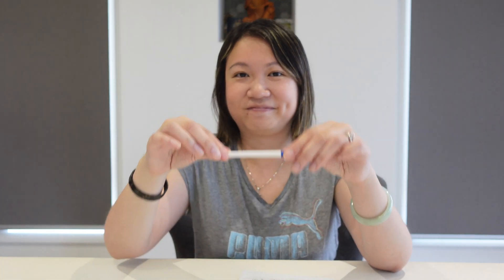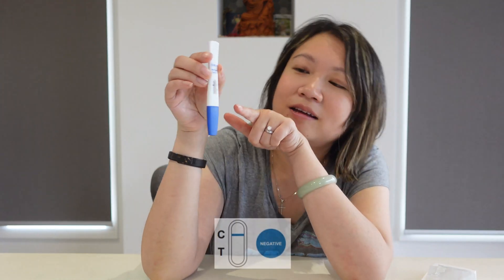Good luck to me! Alright guys, let's see the result after 15 minutes! Ta-da! Here you go! So for my result, the red line is sitting on the C, which means I am negative! Yay!